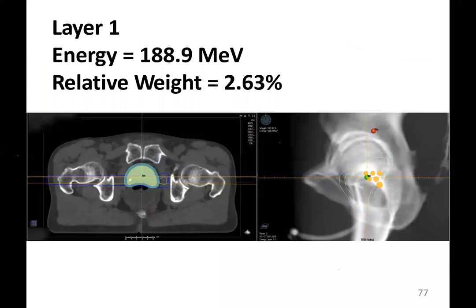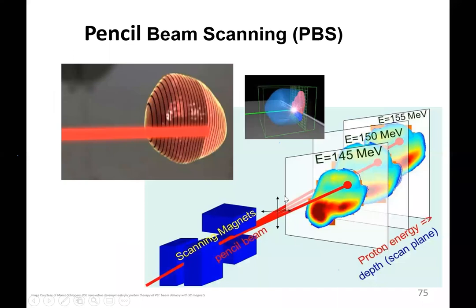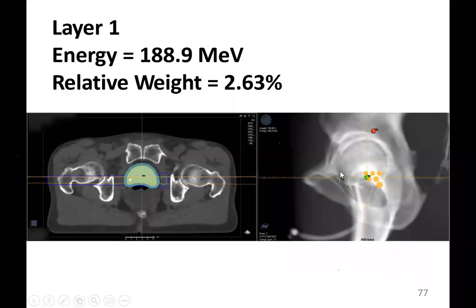This will explain what I meant by the pencil beam spot size, or pencil beam spots. You know that we are precisely placing numerous pencil beams, or proton particles, into the target in order to cover the 3D volume of the tumor with a uniform dose distribution. First, range depends on the beam energy. The scanning magnet adjusts the pencil beam both in X and Y direction. The 3D volume is divided into several slices, layers, perpendicular to the central beam axis, just as I showed you over here. So it delivers the beam to the different layers.